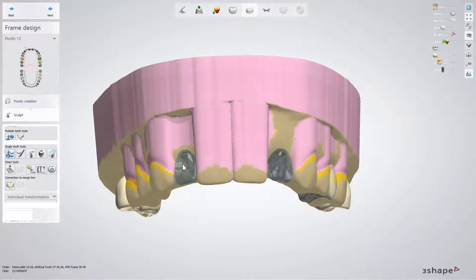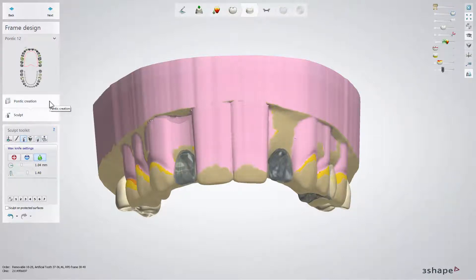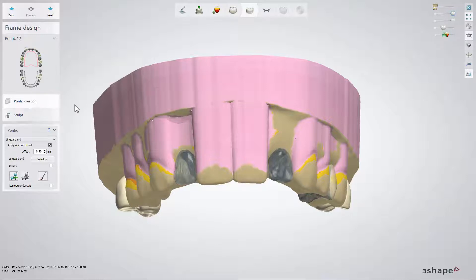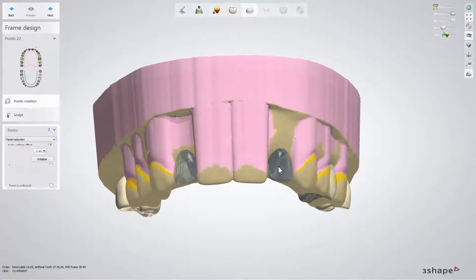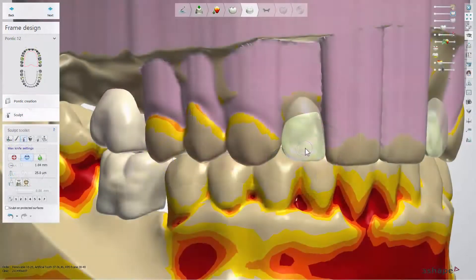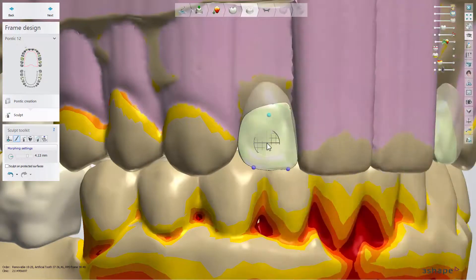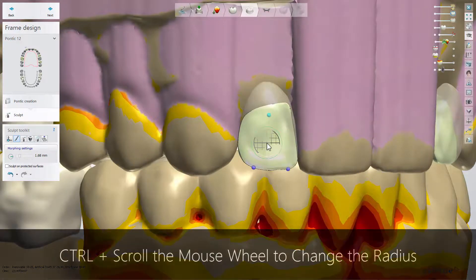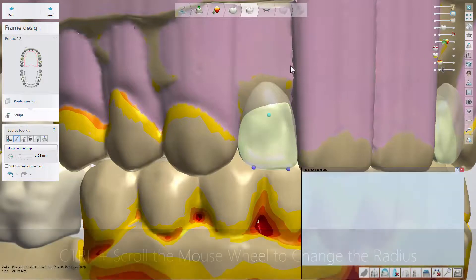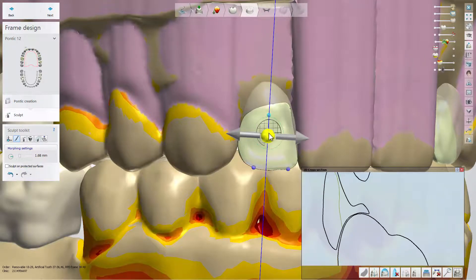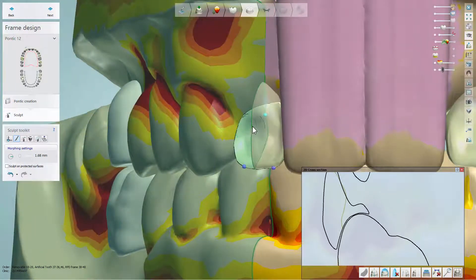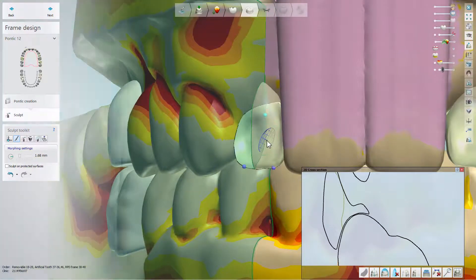The next step is Frame Design. We will click on Tooth 12 and then on the Pontic Creation tab to adjust its shape. From the drop-down menu, we are choosing Facial Reduction. We will do the same for teeth 22 and 25 and move to the Sculpt sub-step. With the help of the Morphing tool, we hollow out the facial surface of our Pontics to decrease their weight. After doing that, click Next.